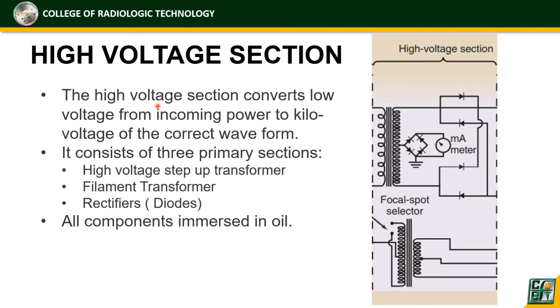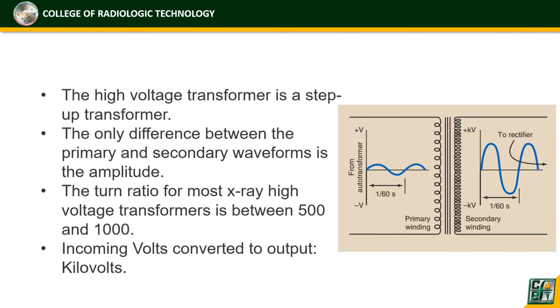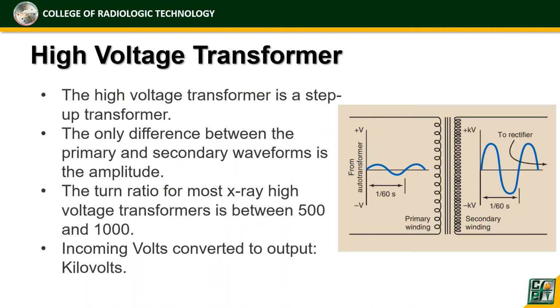However, this high voltage section is located in the transformer or high voltage generator.